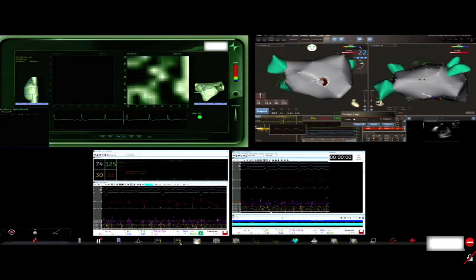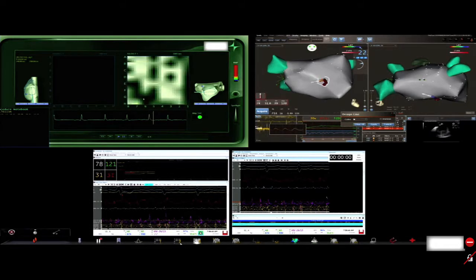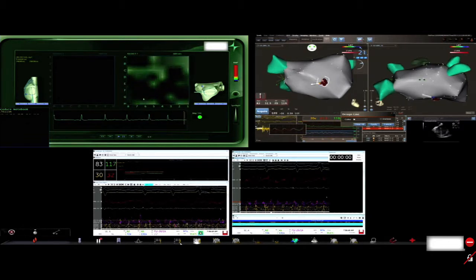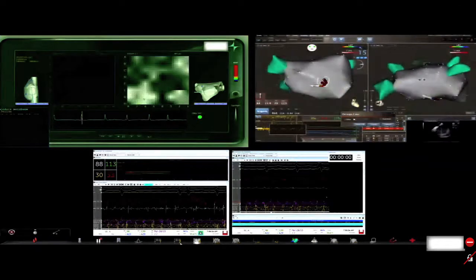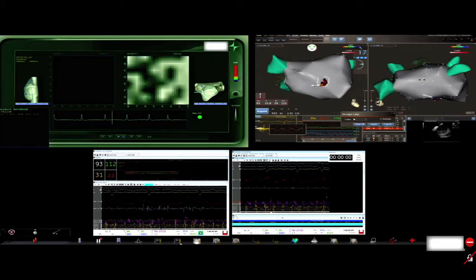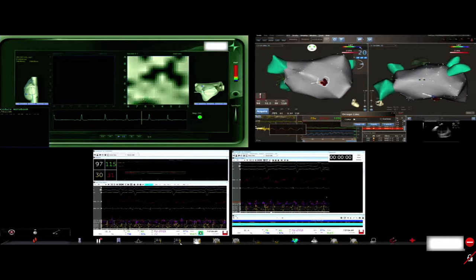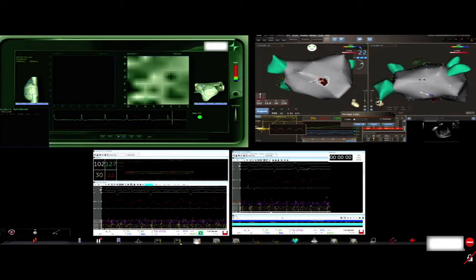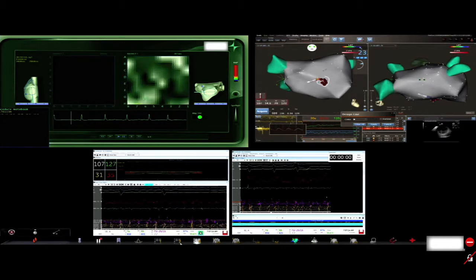We'd start with the left atrium today, so you can at least have an opportunity to see the definition of a few rotors. In this case, we'll map until we can no longer get rotational activity identified in the left atrium on repeated mapping. Once we're done with this, we'll take another acquisition to look at whether the rotation in this area has been eliminated, and whether we can subsequently identify any new rotors.